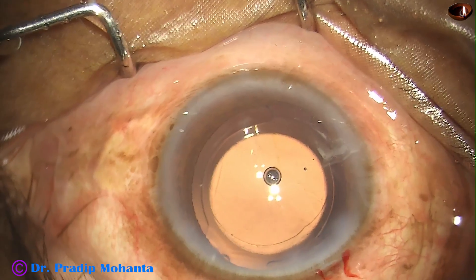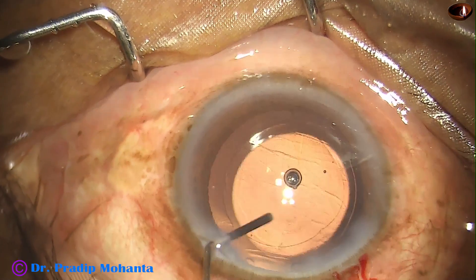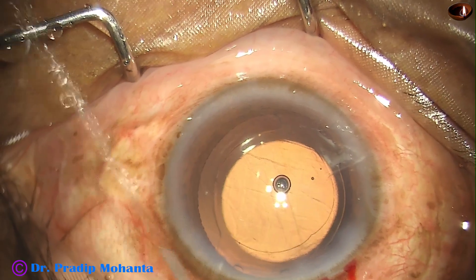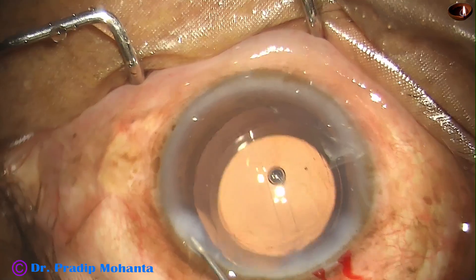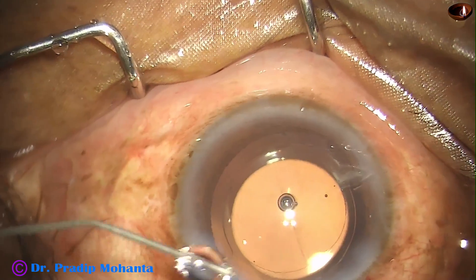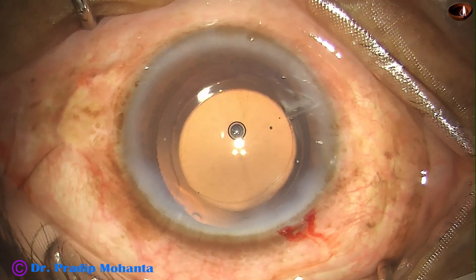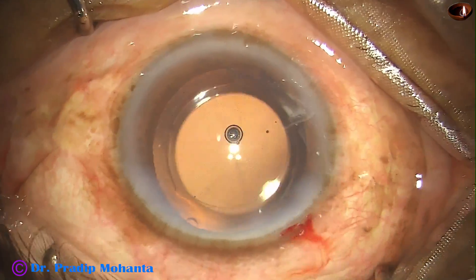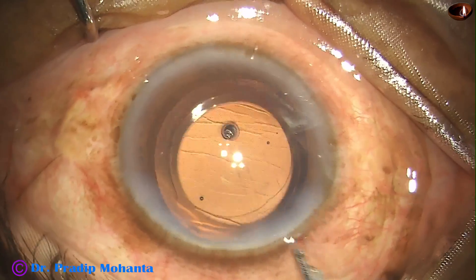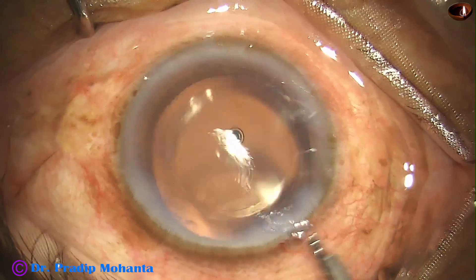And now we are towards the end of the surgery. This is a small bit of moxifloxacin. Now I hydrate the corneal stroma on either side of the paracentesis openings.